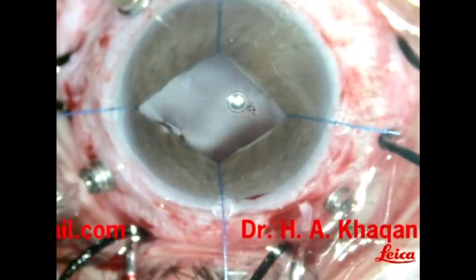Here we can see the area of retinal dialysis. This is a dropped cataractous lens lying on the macula. And here we can see the area of retinal tear.